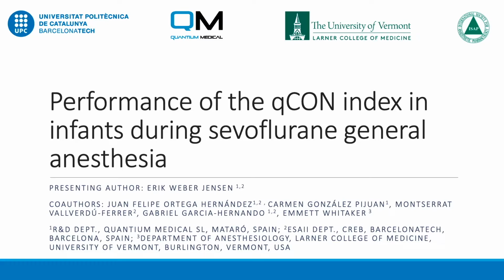For those of you who do not know the qCON index, it's a processed EEG index, which is implemented in the qCON monitor. I also have to disclose that I am an employee of the company Quantum Medical, which is the manufacturer of the qCON monitor.